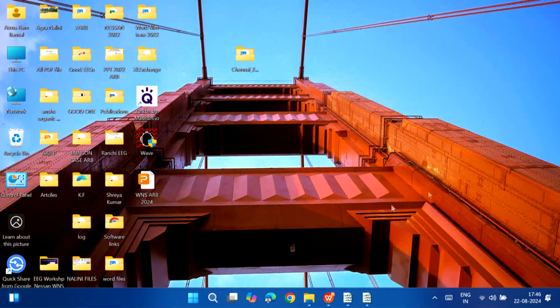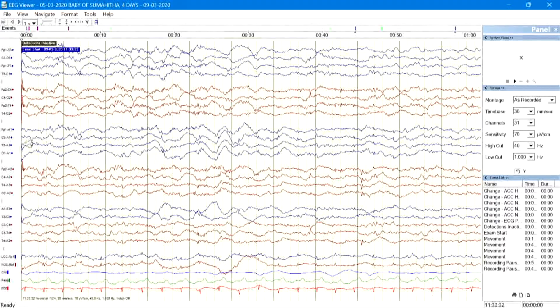Yeah. Let us do the newborn. Okay. Yeah, this one. So we'll briefly read some of the EEGs, live EEGs.